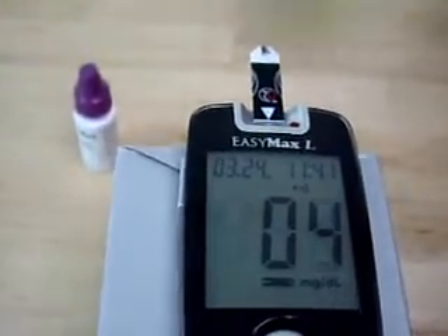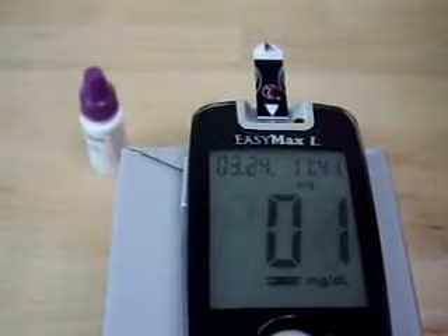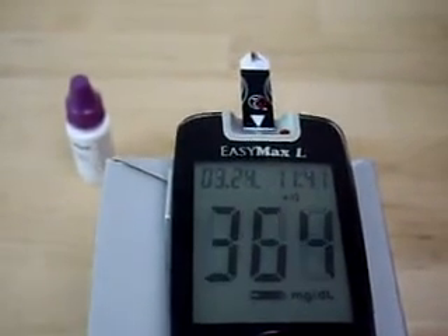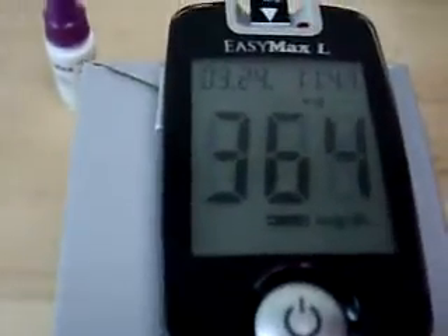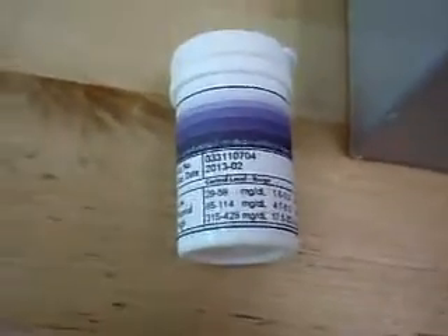When you hear the beeper, you have enough control solution in the test strip. The meter starts to count down from 5 seconds and will show the results. Check if the reading falls within the range printed on the test strip bottle.